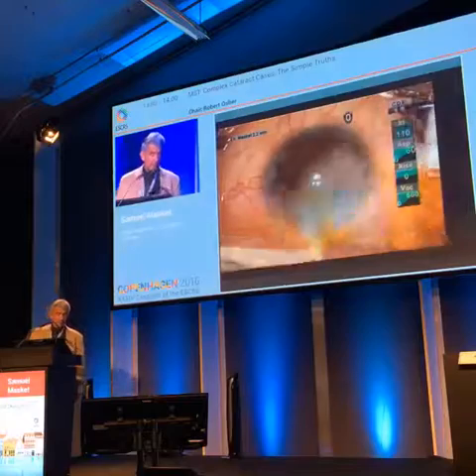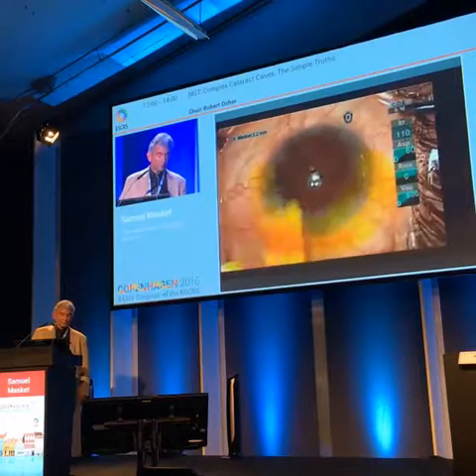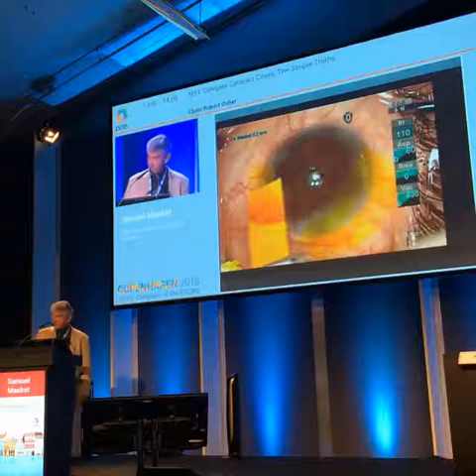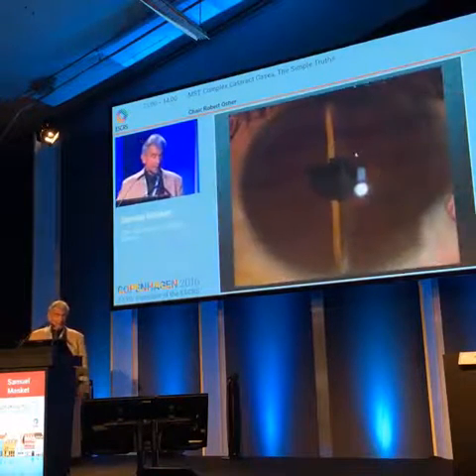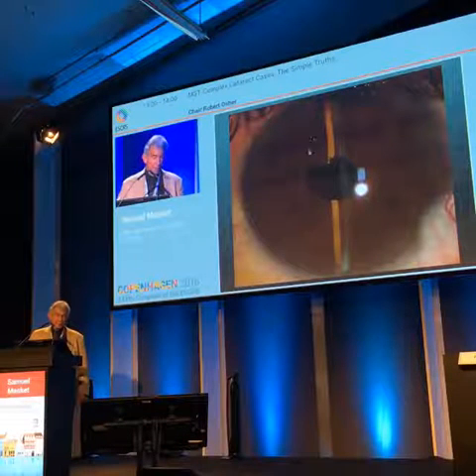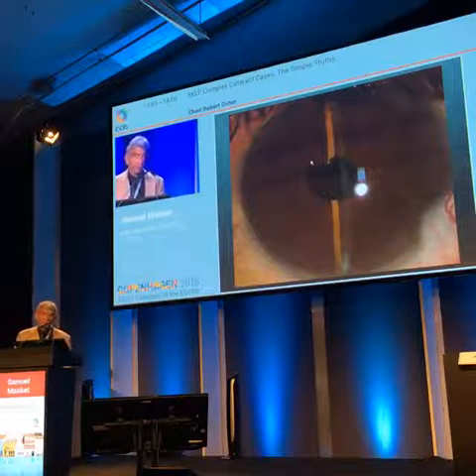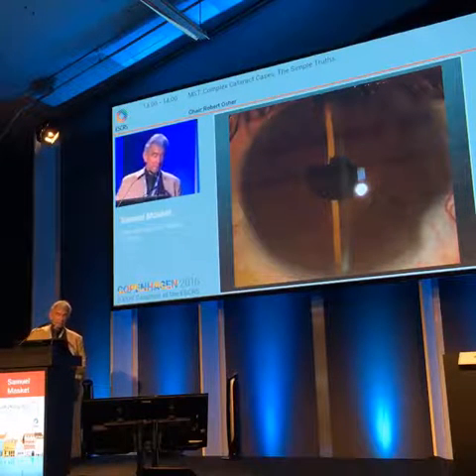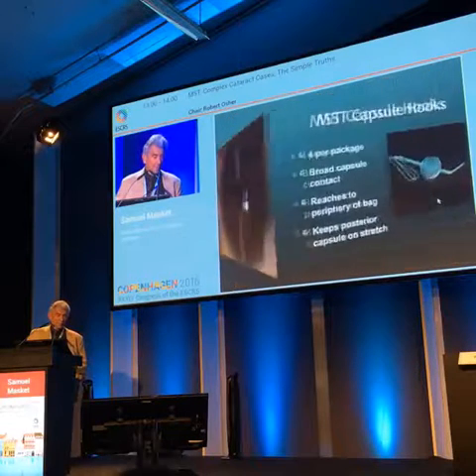And again, here at the end of surgery, we'll check to make sure that all incisions are hermetically sealed. Post-operatively, I missed a little bit of the iris scroll with the vitrector, but you get the sense that you can create a round central pupil, and obviously this is very helpful to the patient rather than having that infratemporal defect. You went on to have normal post-operative vision.